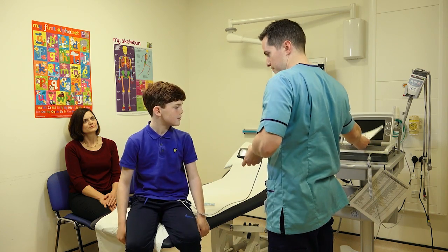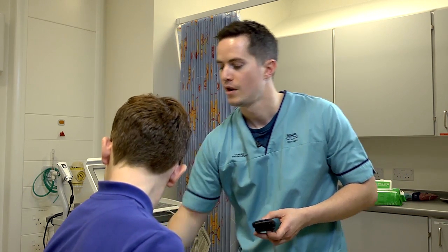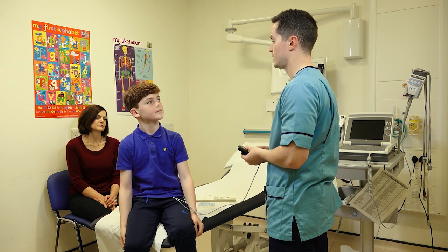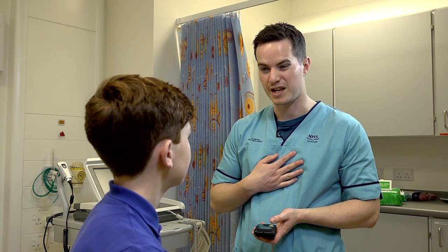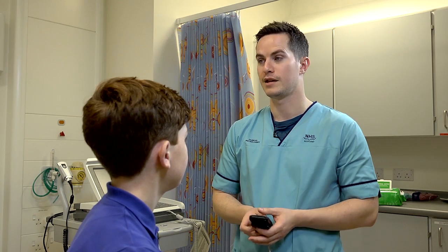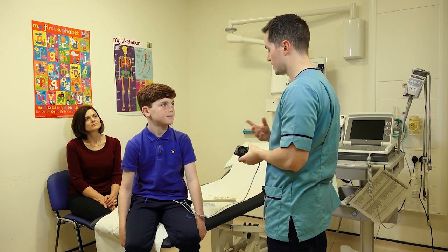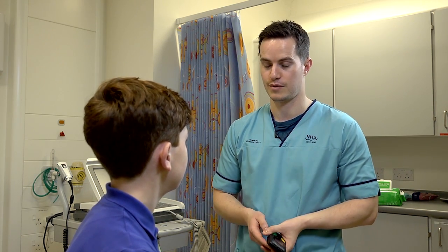I'm going to give your mum a diary. Basically the diary is for you to tell your mum how you're feeling while you're wearing this monitor. If you have any symptoms — anything like funny heartbeats, feeling sore, lightheaded, or breathless — let your mum know and she'll write it down in the diary. That way when we analyse the tape later, we can see how you were feeling while wearing the monitor.